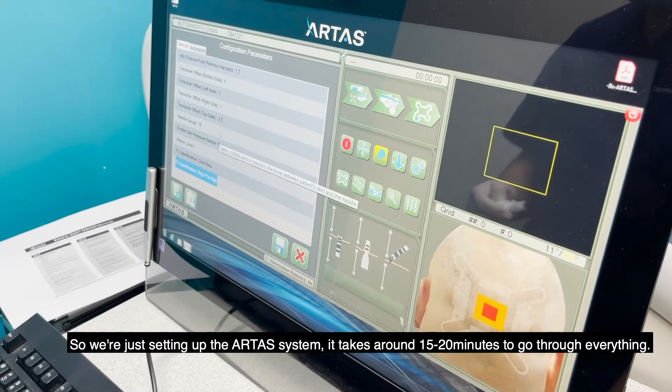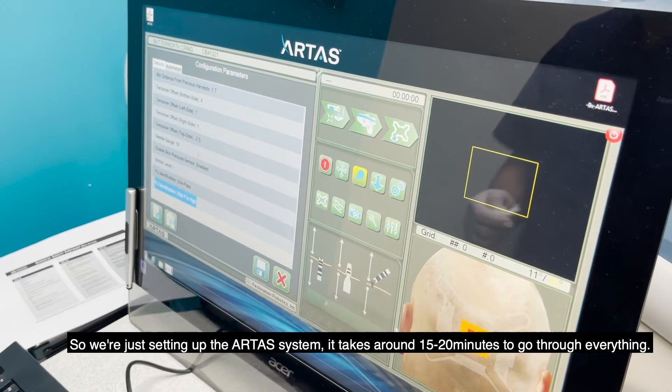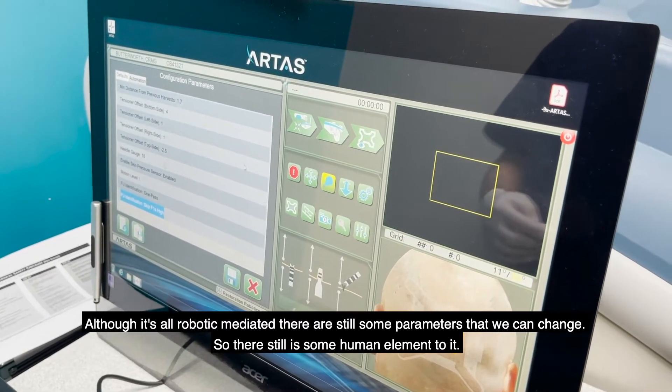We're just setting up the RTAS system. It takes about 15-20 minutes to go through everything. Although it's all robotic mediated, there are still some parameters that we can change, so there is still some human element to it.